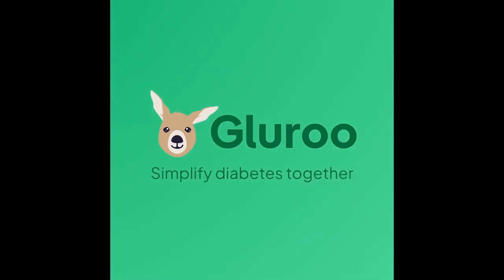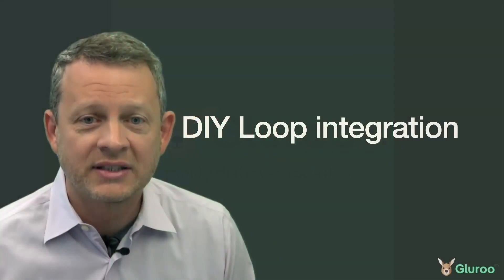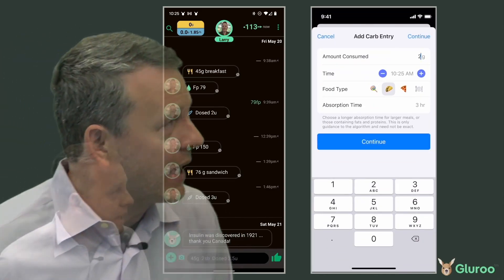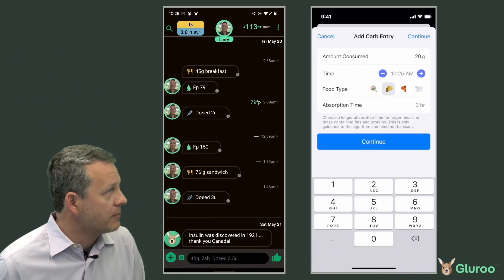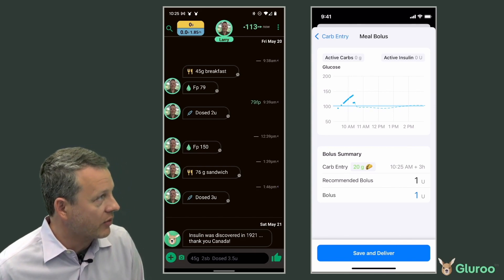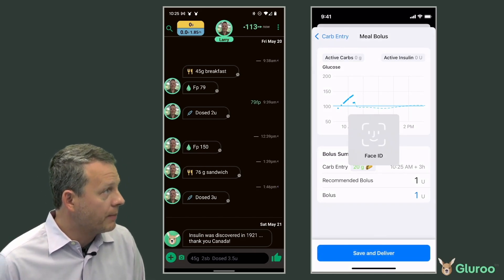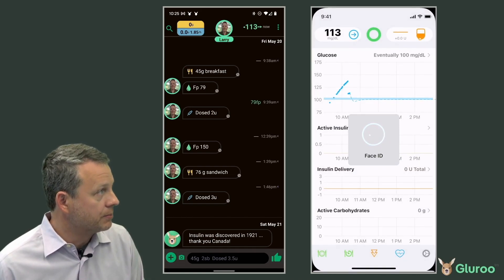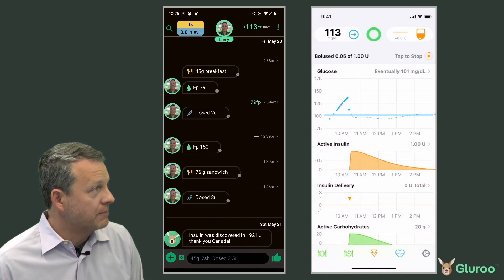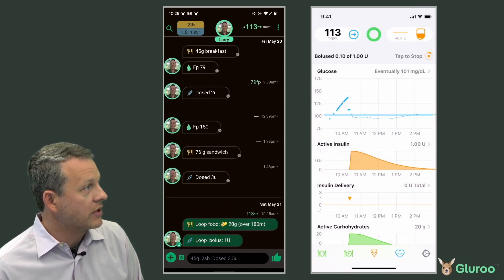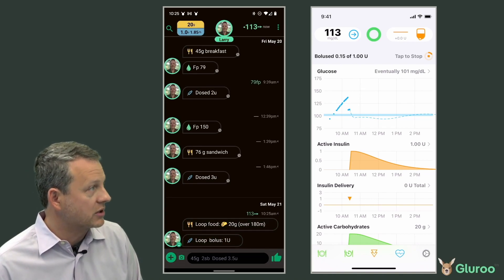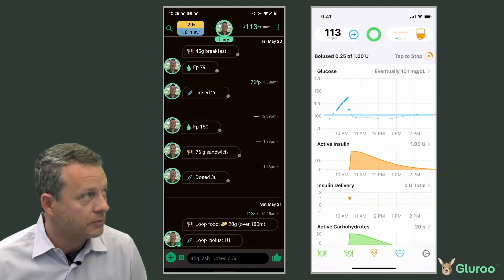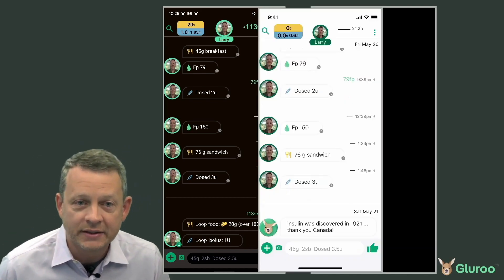Gluroo also integrates nicely with DIY LOOP. Here we have LOOP running on an iPhone on the right and another member of the Gluroo crew running Android on the left. A carb entry and the corresponding bolus entered into LOOP shows up almost immediately on the Android phone, so that you can follow a looper regardless of what kind of phone you have. Edits made in LOOP get propagated to Gluroo right away too.